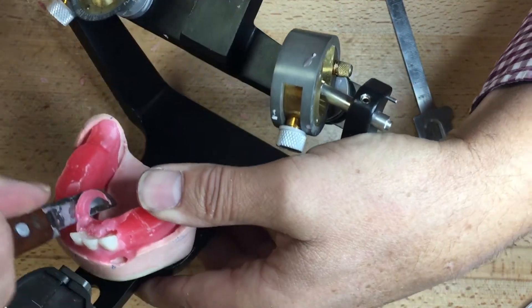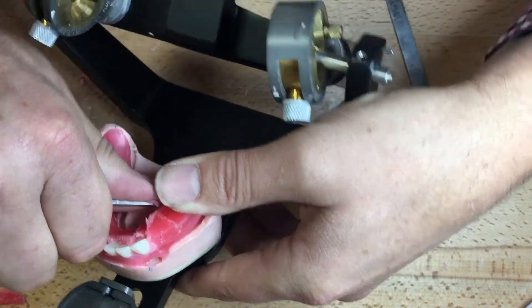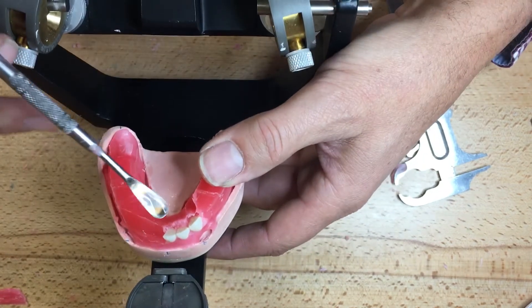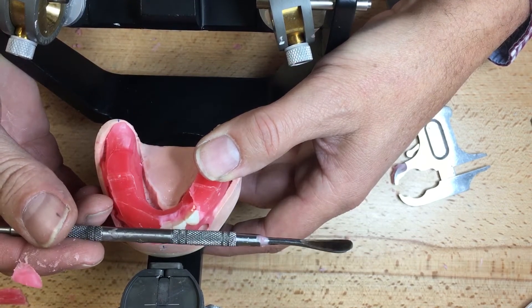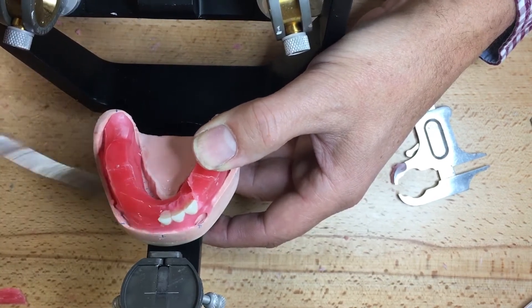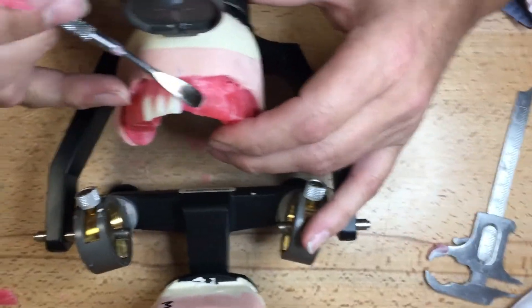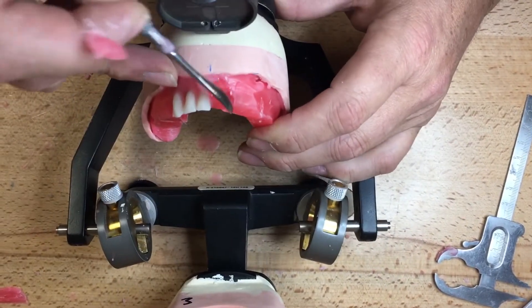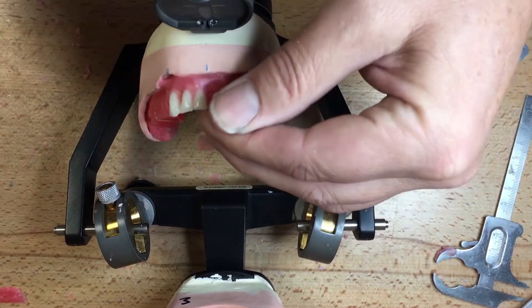I'm taking off this excess wax on the lingual, hopefully without moving any of the teeth. I'm keeping my posterior point stops and my rims. Since I've taken out the incisal pin, I can see that my anteriors are just at the extent — the centrals are just a hair outside the labial, labial to the mandibular ridge. Moving on to the corresponding central.